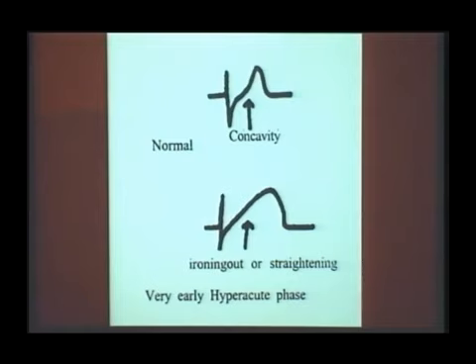With ironing out of this concavity is the earliest sign of subepicardial injury. Within minutes you are going to have this change. No elevation. It is only the slope elevation. Many times this is missed.